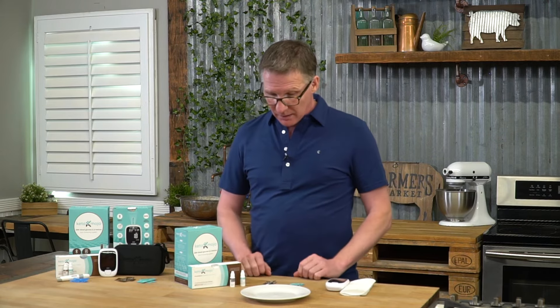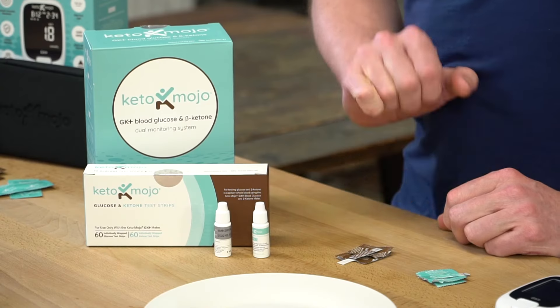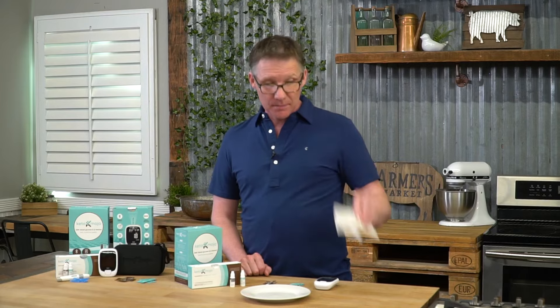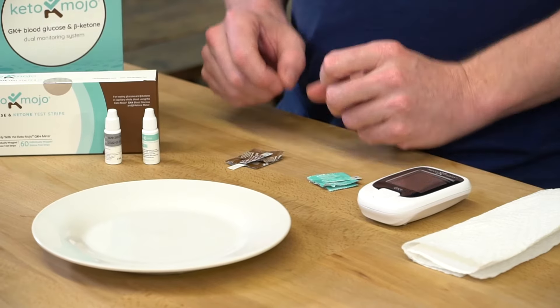I've already prepared. I have my controls, my glucose strip, my ketone strip, and my meter. I also have a paper towel in case I spill anything. For this purpose, I'm using a non-porous plate so that the camera can see it really well. Normally at home, I actually just use the side of the wrapper.